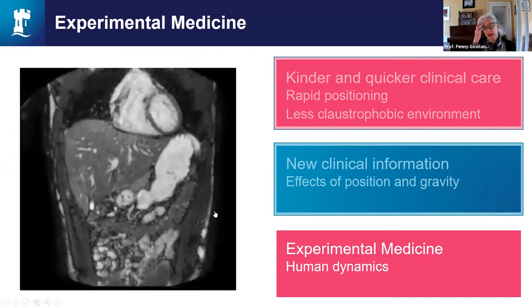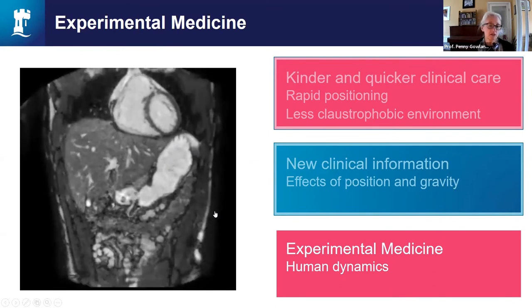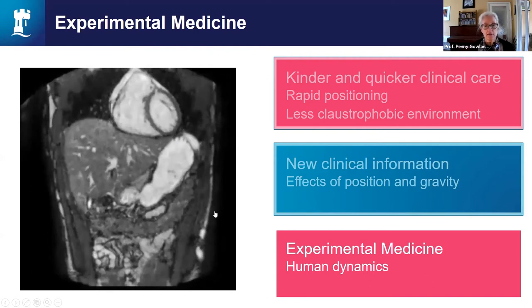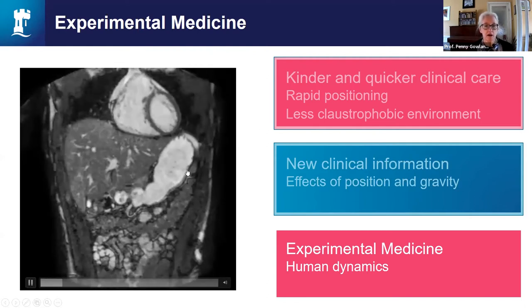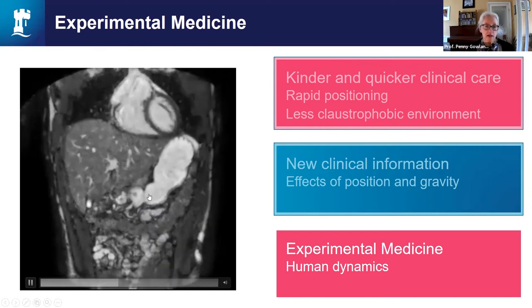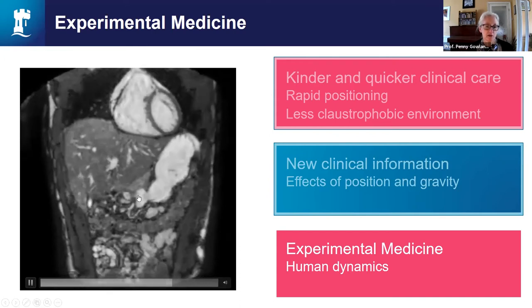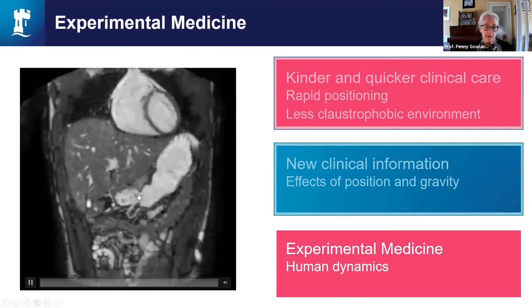Another area that I actively work in is gastrointestinal function. And we've been looking at GI function now for a very long time at Nottingham. And this is an image of the stomach emptying. So here are the lungs again, here's the liver, the heart, and here's the stomach. And you can see it emptying, or at least appearing to empty. There's a whole story about what's actually going on here. But it's being mixed and ground in the pylorus here.